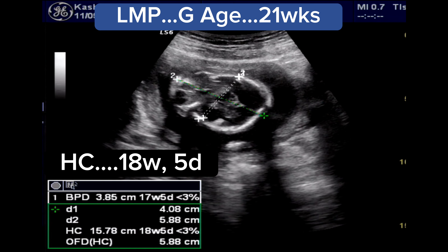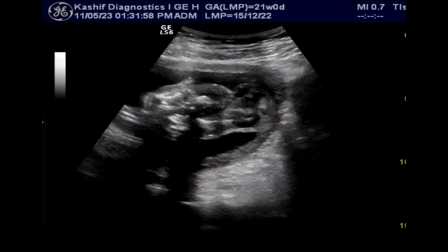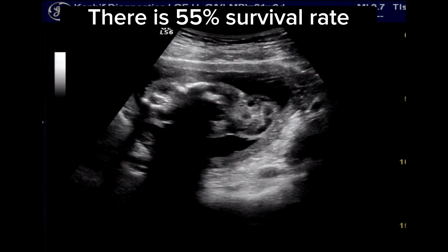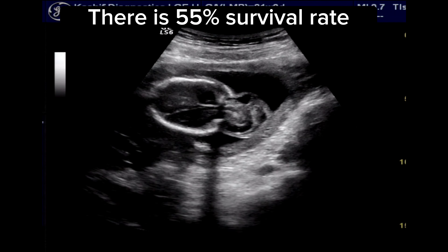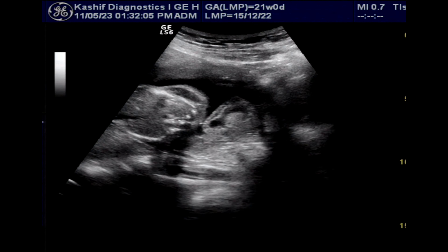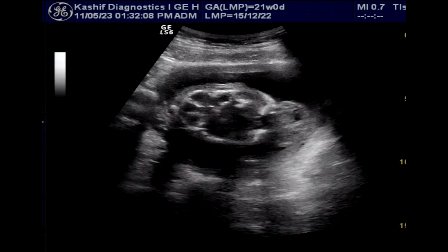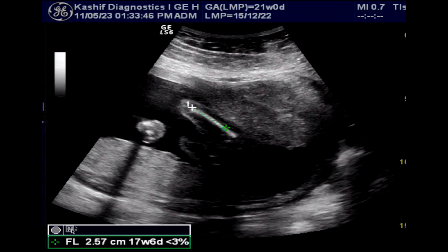BPD measures 17 weeks 5 days and head circumference measures 18 weeks 5 days. There is a 55% survival rate for these babies, but survivors often suffer lifelong complications.